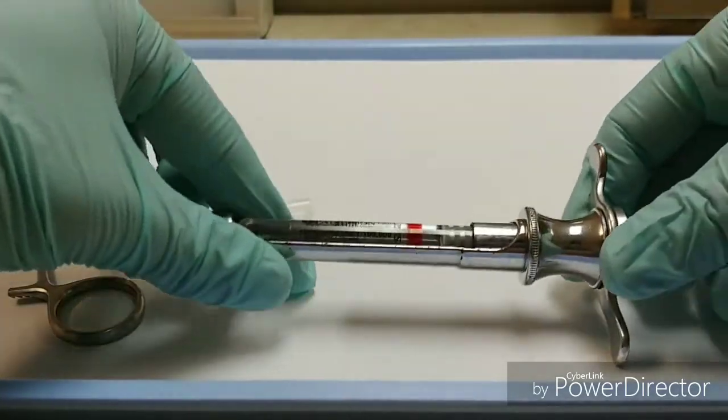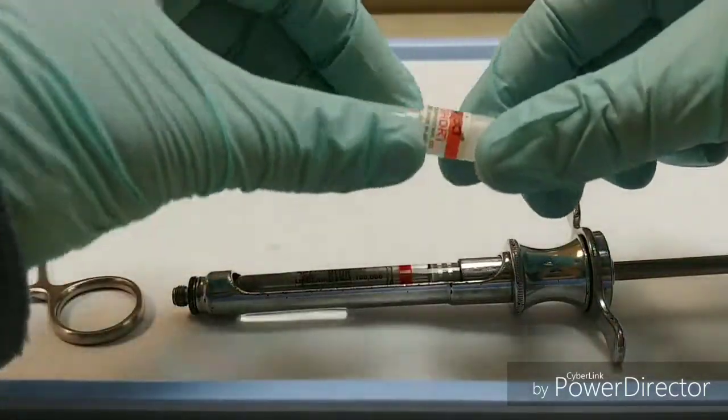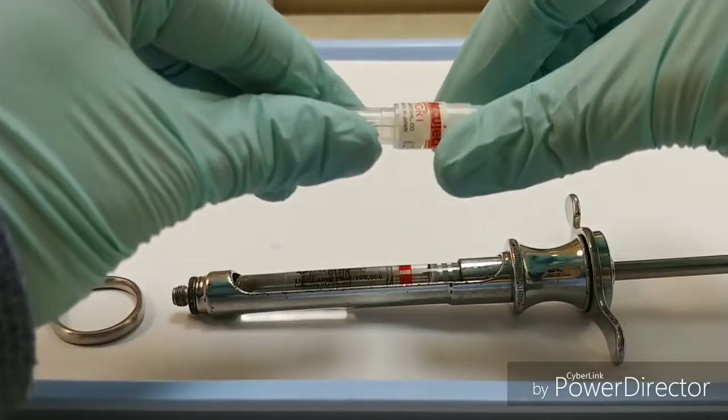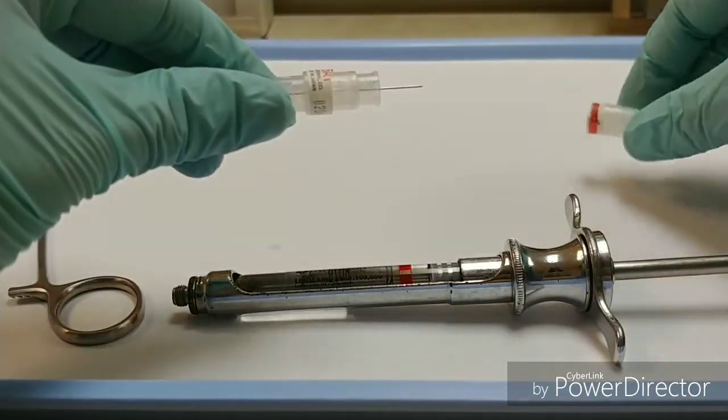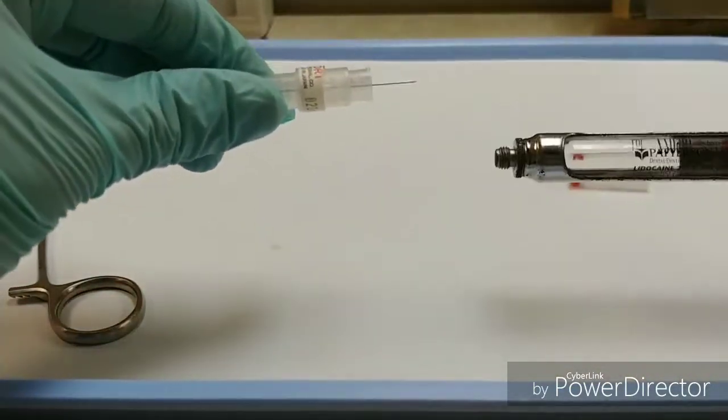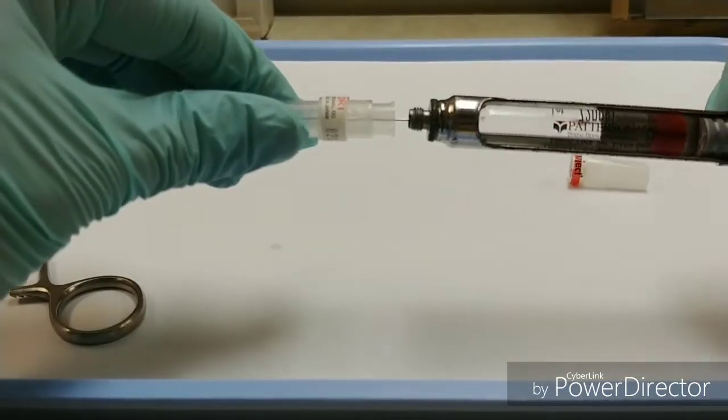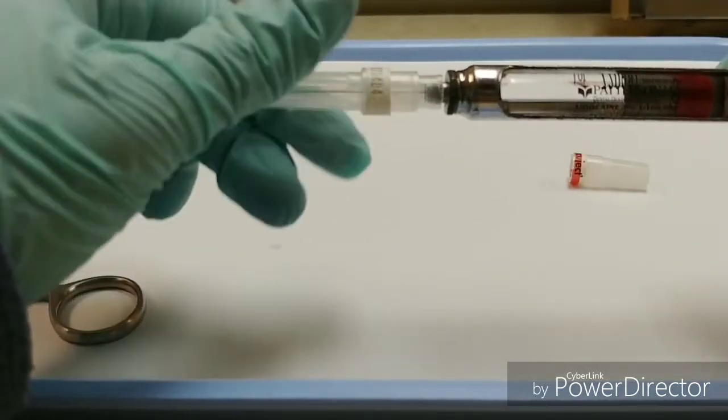Next, I'm going to attach the needle, so I will uncap my cartridge penetrating end of my needle, and then I can attach it to the needle adapter of the syringe, like so, just screws on.